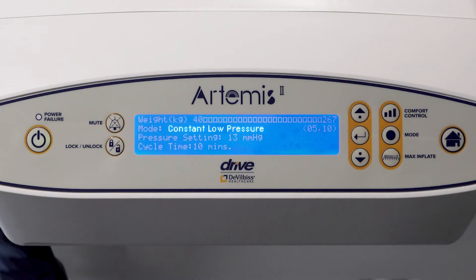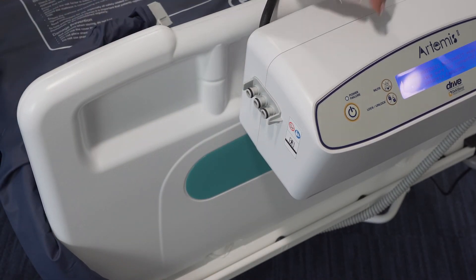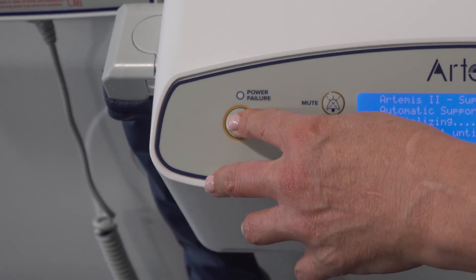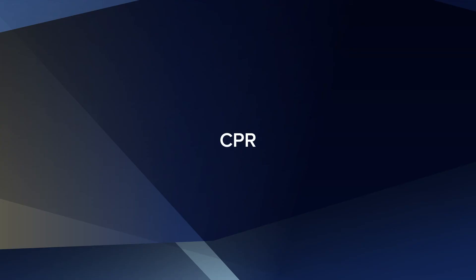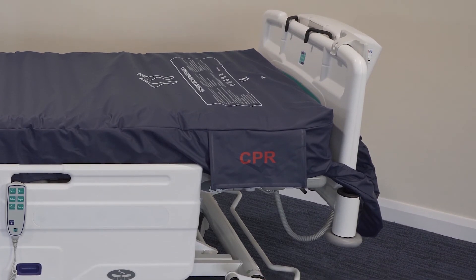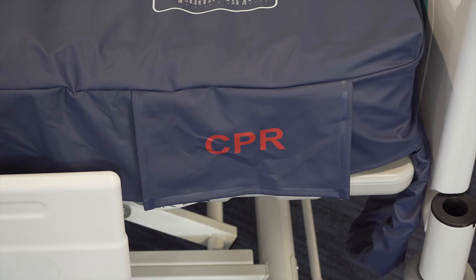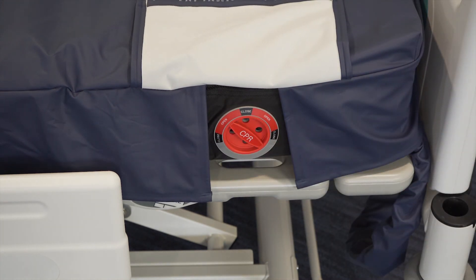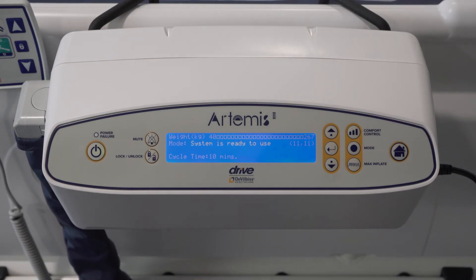Switch modes from alternating to constant low pressure and wait for all cells to inflate before transporting the patient. Remove the air connector, which has a non-return valve, from the control unit, then turn off the control unit. The mattress stays inflated for up to 24 hours in normal conditions. Rapid deflation may be required for emergency treatment — turn the CPR dial to open. Turn the CPR dial to closed to re-inflate. Wait for the mattress system to reach optimal pressure prior to returning to normal use. Once re-inflated, ensure the correct settings are re-selected.